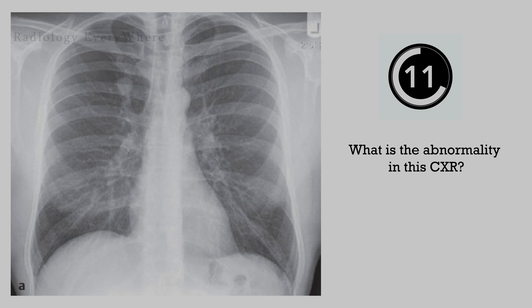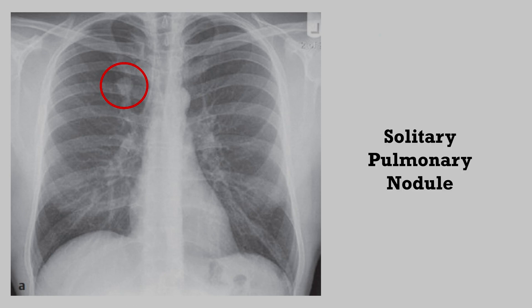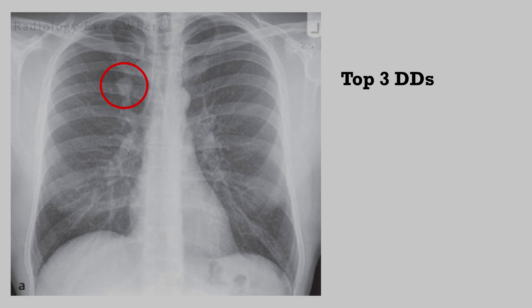The X-ray shows a solitary pulmonary nodule within the right upper lobe, and the rest of the chest X-ray is normal. The key imaging finding is a solitary pulmonary nodule. What could be the differential diagnosis in this case?